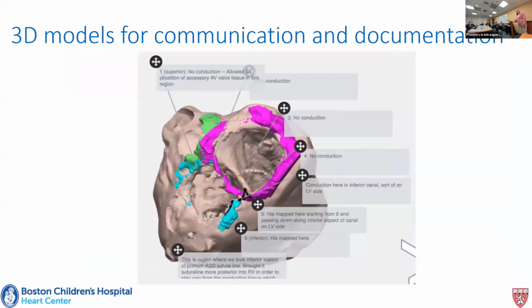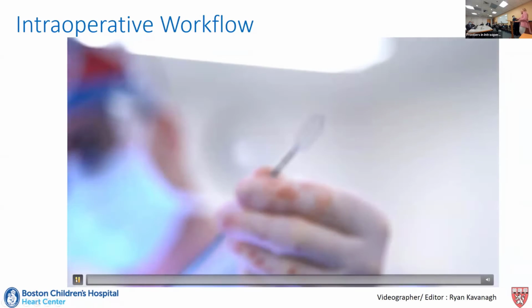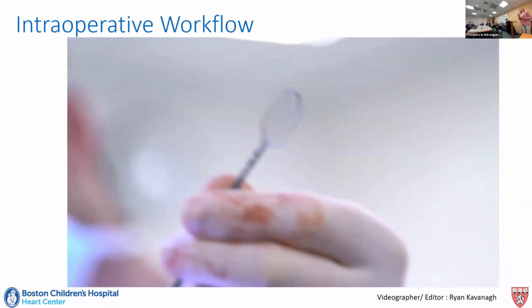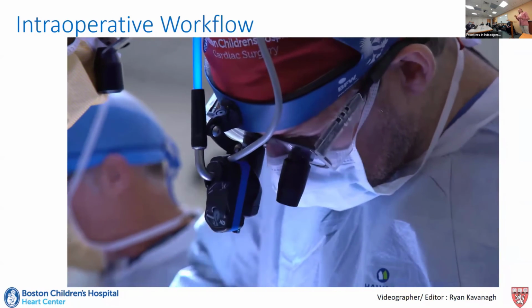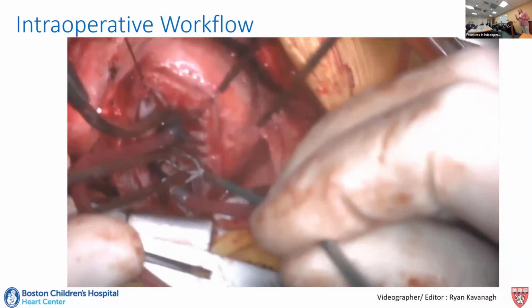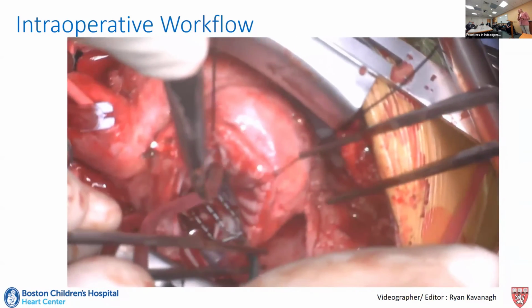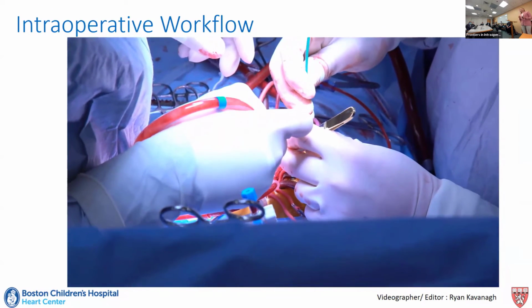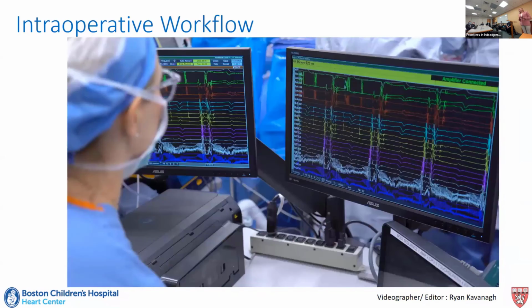I'll show you this brief video, hopefully. So this is the surgeon marking the catheter. These are designed to be used with electroanatomic mapping where you don't need to mark externally. Not sure the audio is going to be quite loud enough, especially for those joining on Zoom.